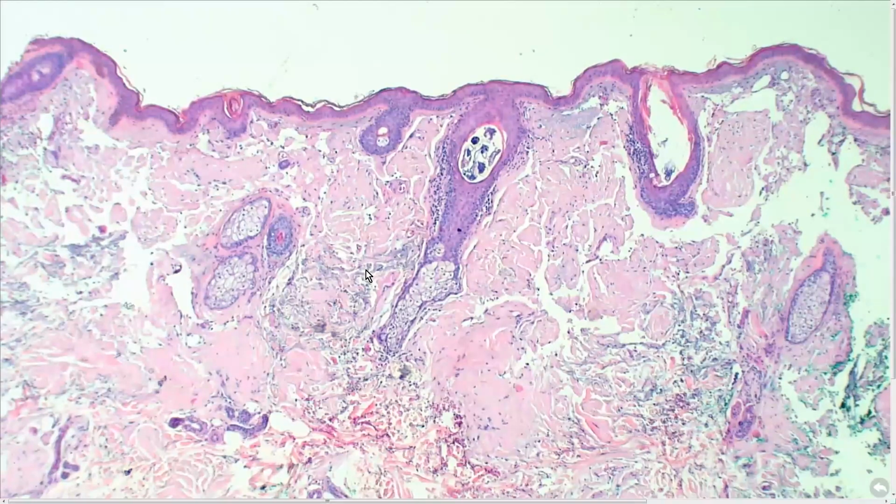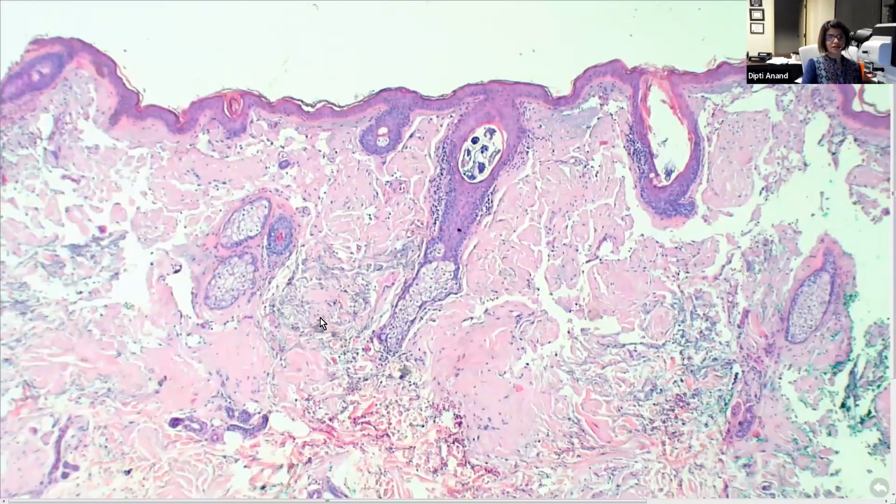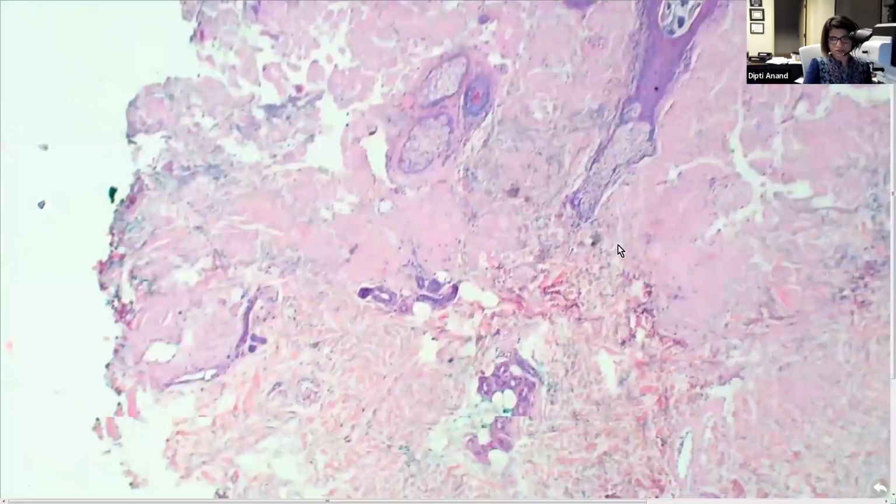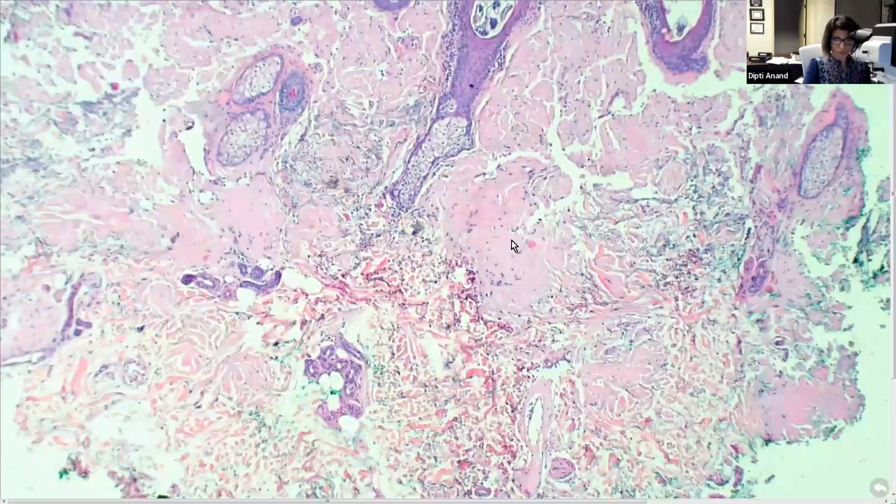So this looks like a lot of pink amorphous material that makes me think more like nodular amyloid. It is. And notice that it produces artifactual clefts in the dermis. So that's normal for any deposition disease, right? And then it has this amorphous pink substance, so the loss of the normal collagen architecture. So this is normal, right here is normal. This is abnormal.